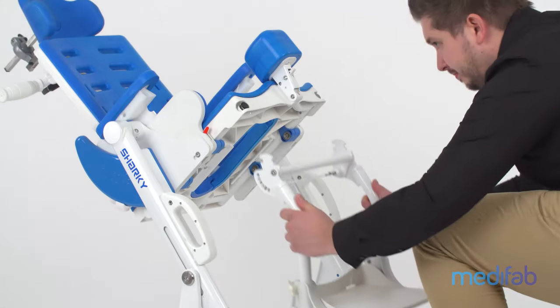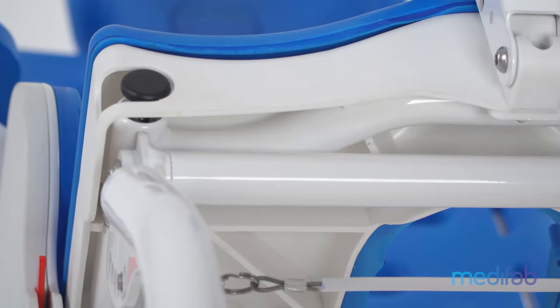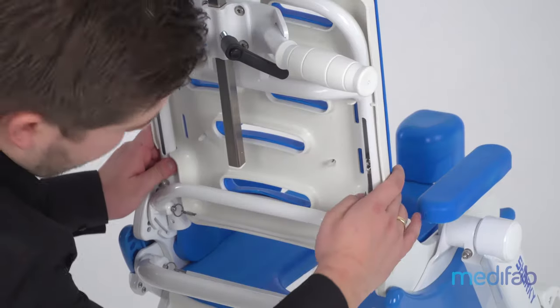Reattachment is done in the same simple way. Also removable, the entire back can be easily pulled out.